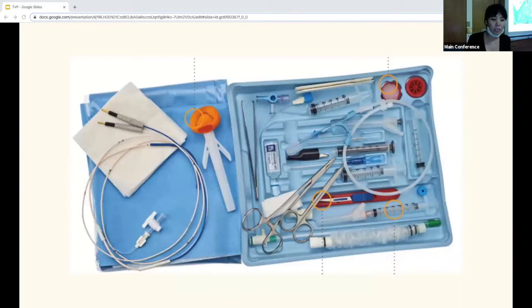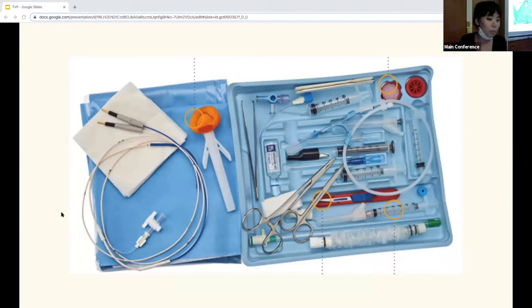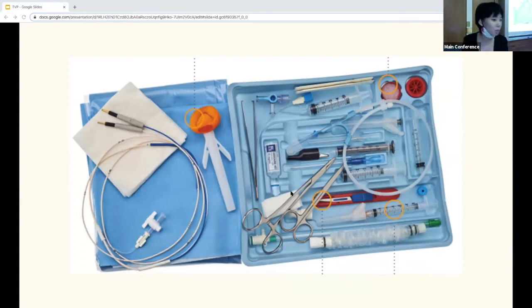So this is what is inside the kit. In particular, I want to point out the sheath and the cordis itself. This is the sheath, this is the cordis, and it's already pre-loaded with the dilator. There's also a syringe that will inflate the balloon, and it's already stopped at 1 cc. So you want to check the balloon.